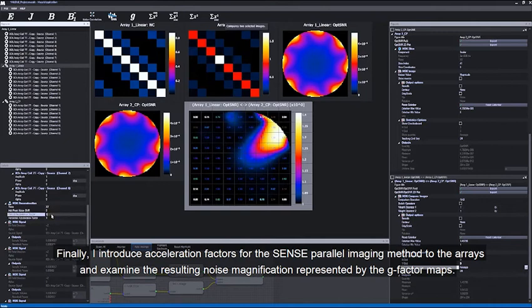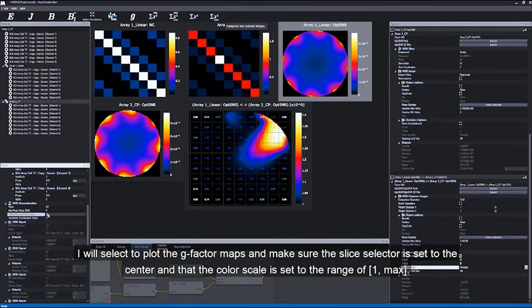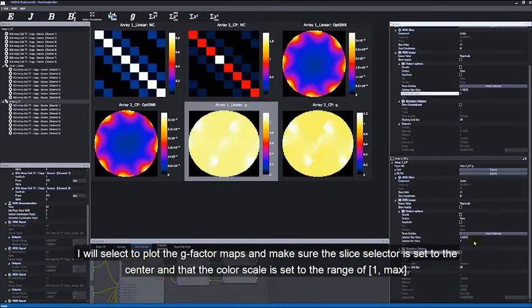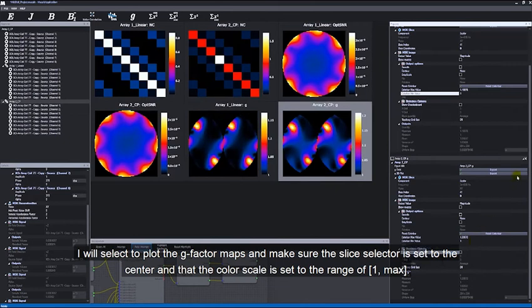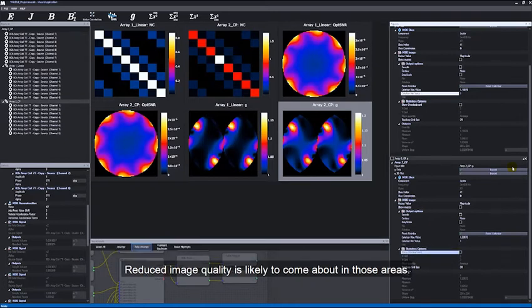Finally, I introduce acceleration factors for the SENSE parallel imaging method to the arrays and examine the resulting noise magnification represented by the G-factor maps. I will select to plot the G-factor maps and make sure the slice selector is set to the center and that the color scale is set to the range of 1 to max. The G-factor maps identify areas that are more affected by reconstruction aliasing due to the multi-channel acquisition approach. Reduced image quality is likely to come about in those areas.